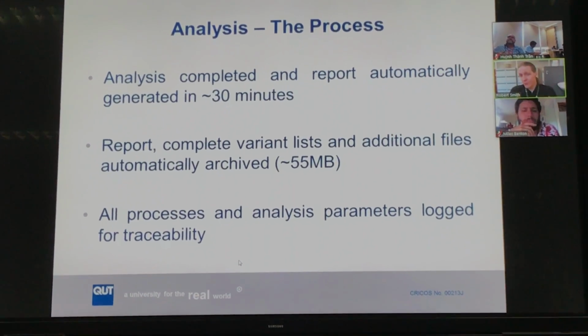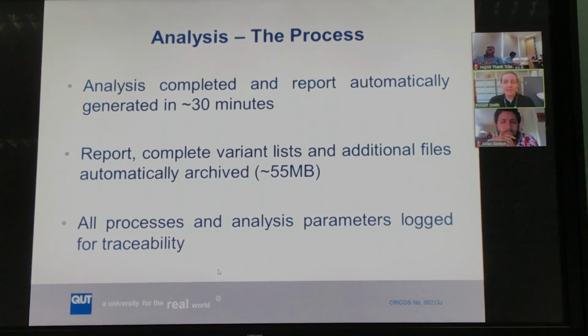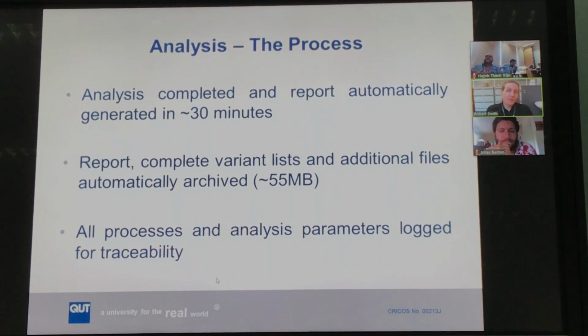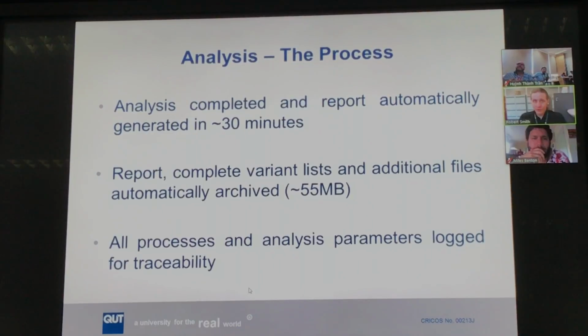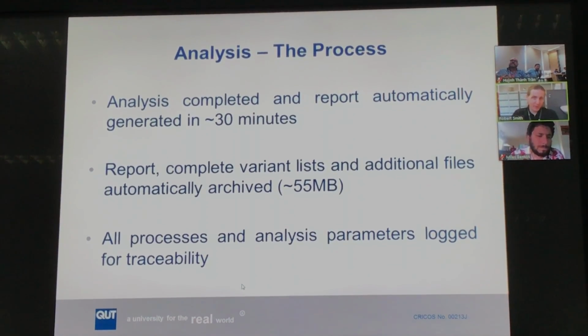And when the report is complete, along with the report that is generated, a complete variant list and additional files are automatically archived by the system. And that's useful for us from a diagnostic perspective because we need to have version control and continue to know when a thing is analyzed, how it is analyzed, and keep records of this thing.